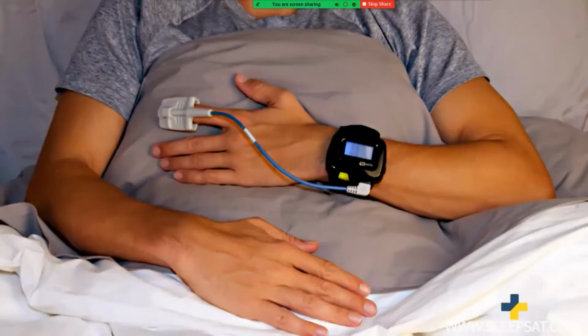An oximetry test has been ordered by your clinician to monitor your oxygen levels and heart rate while you sleep. There is no alarm on the SleepSat device, and it is not intended for real-time monitoring. For best results, remove nail polish. Avoid laying on the hand with the sensor, putting it above your head, or tucking it underneath a pillow.